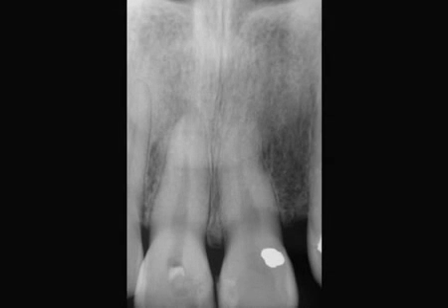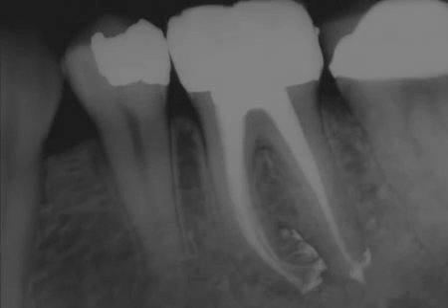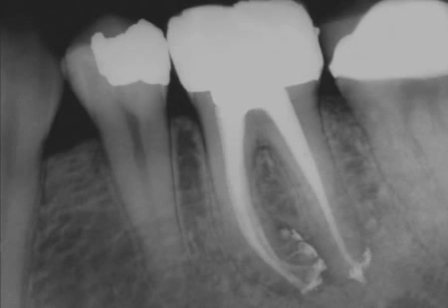In this preoperative film of a maxillary central incisor, note the previous access, over-instrumentation apically, and a canal that exhibits reversed apical architecture. A postoperative film demonstrates treatment of a Type 1 transportation. Shaped canals provide resistance form to hold gutta-percha. Here's another Type 1 transportation managed with vertical condensation of warm gutta-percha. Even though the MB preparation apically exhibits minimal resistance form, excellent hydraulics could still be generated during the pack.